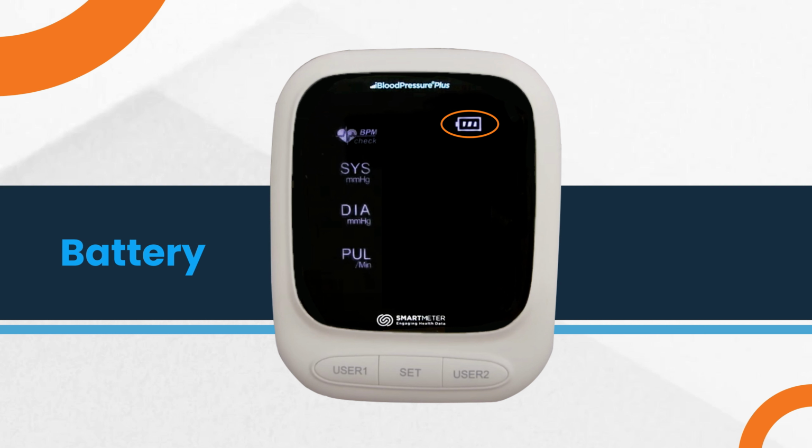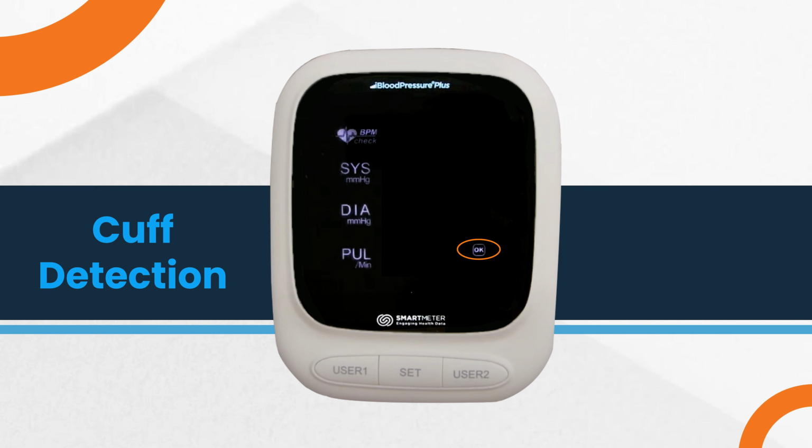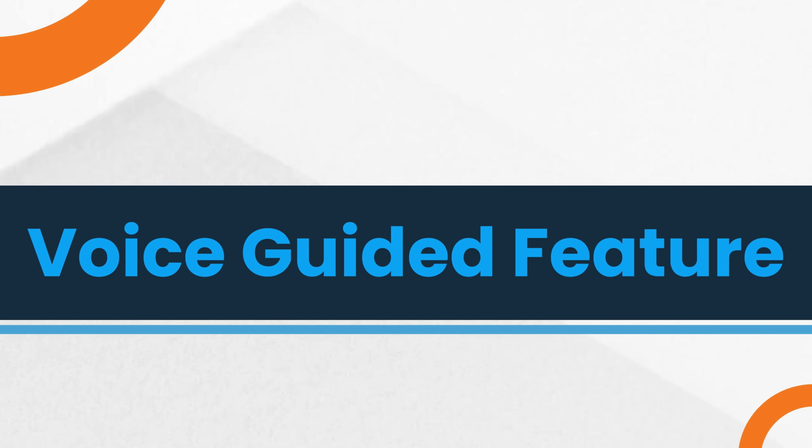The battery icon will indicate the charge level. The signal strength indicator is the bars which show your connectivity. The cuff detection will either say OK or No, alerting you if your cuff is placed correctly. The iBloodPressure Plus also has a voice-guided walkthrough feature.